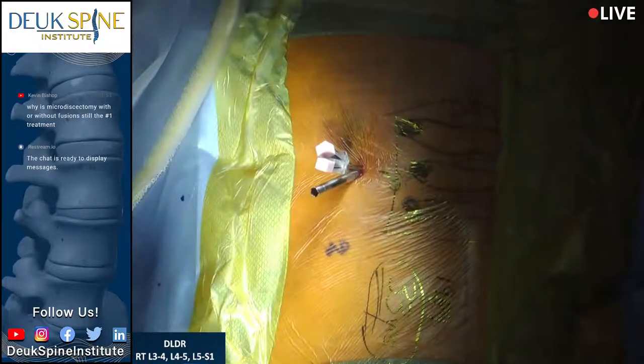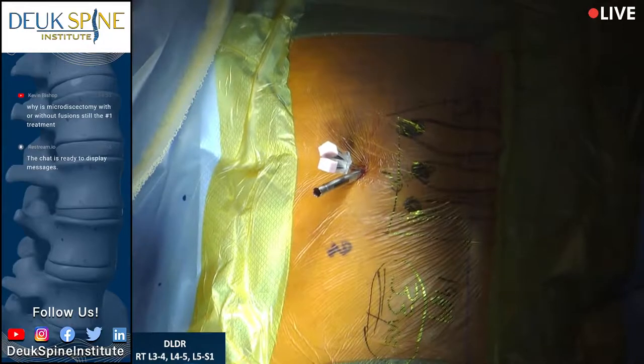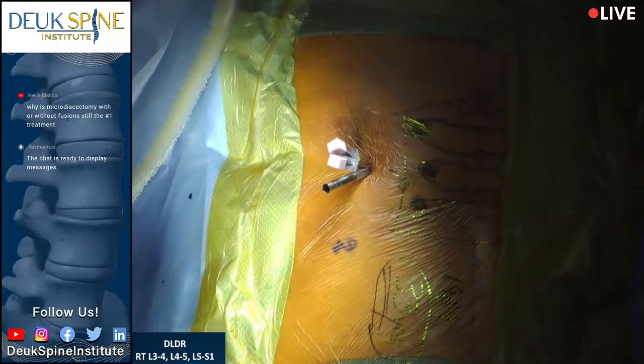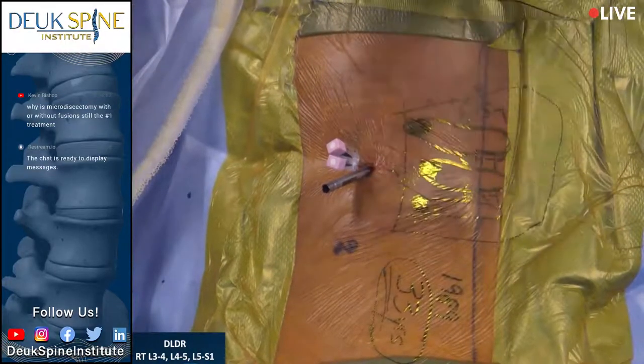Now, folks, let me show you what would happen if we were doing fusion. And I'm going to show a video in just a moment that is going to show you what we're doing. It's called the Deuk laser disc repair. And we're fixing three discs that are herniated.